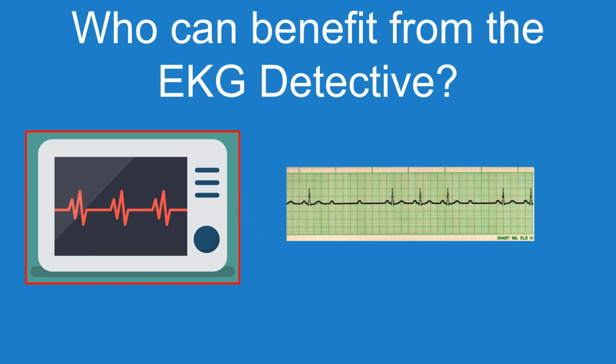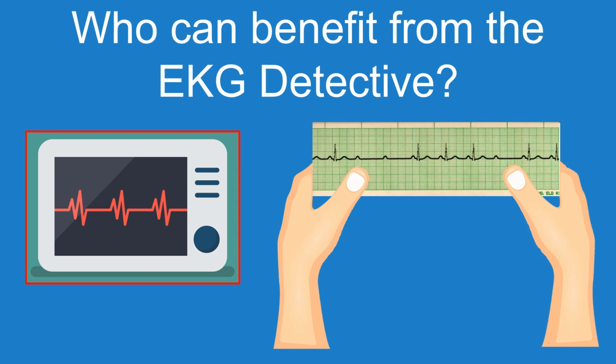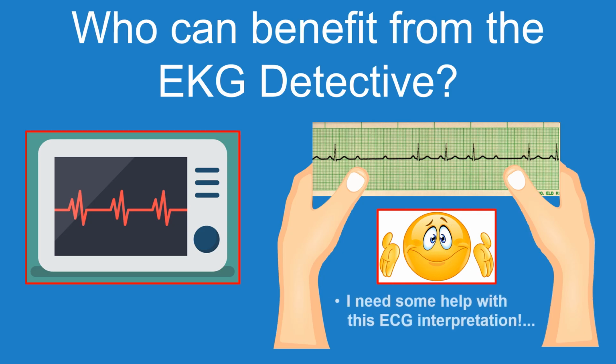So the biggest question to ask is, who can benefit from using EKG Detective? And the answer to that is anybody who is struggling with ECG interpretation. The nice thing about this process is it allows you to focus on the waveforms and the things that you can see in the ECG, and you don't have to spend as much time focusing on the criteria within an ECG.